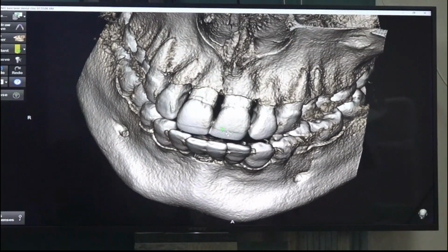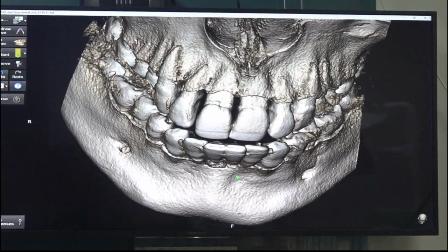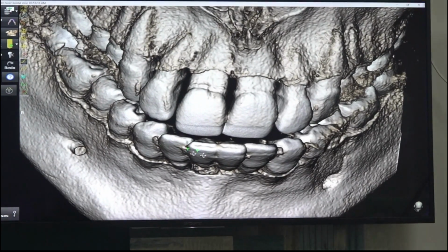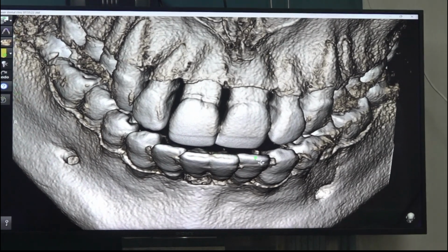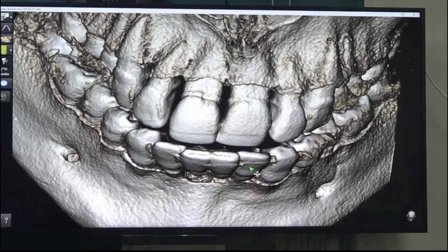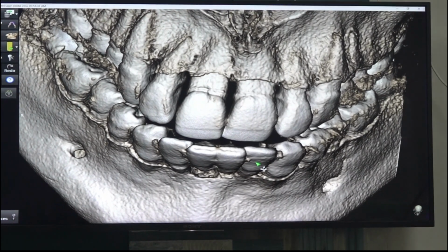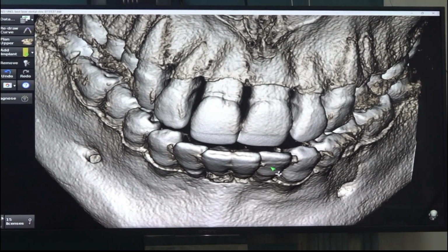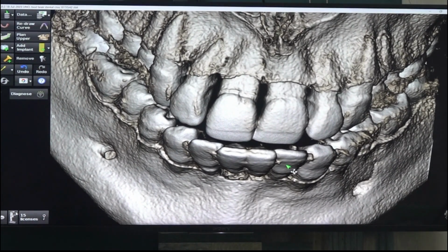The first thing is how many teeth you are going to replace and what the mesiodistal space available is. That you also need to consider, because here it looks as though we are going to replace 4 incisors, but they are a little proclined and light crowding is there, and the mesiodistal space won't be enough for exactly 4 incisors. You may have to give a smaller size 4 incisors or bigger size 3 incisors. The same challenge we will expect when there is too much crowding. There will be 4 incisors, but they will be crowded against each other, and post extraction you can place only 3 incisors.